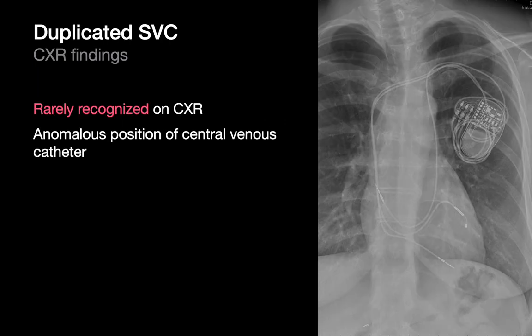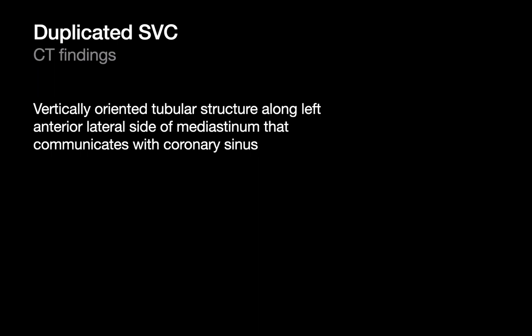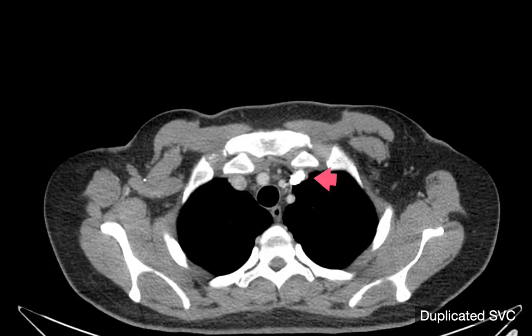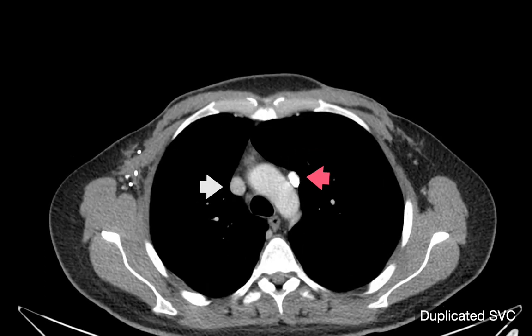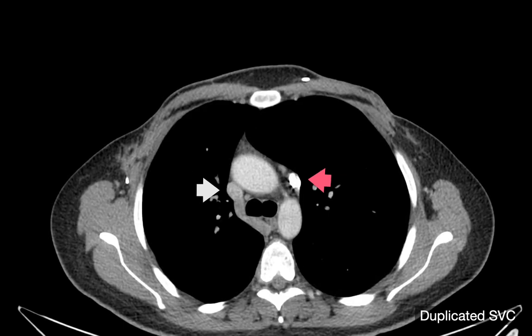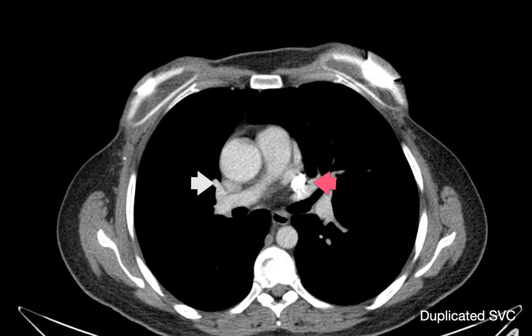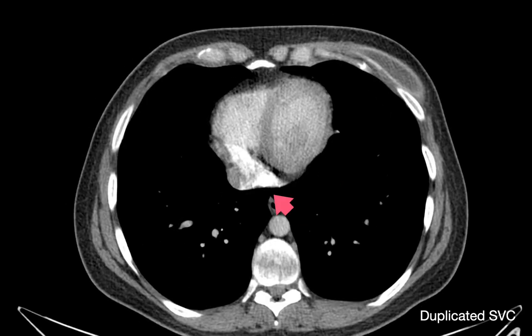Duplicated SVCs are an anatomic variant that's usually not picked up on CT unless a catheter or other central venous device happens to be coursing within a left-sided SVC. On this image, you can see two cardiac conduction leads reaching the heart via the right SVC and one via the left SVC. On CT, you'll recognize a duplicated SVC when you're scrolling and see a tubular structure in the left mediastinum that connects with the coronary sinus. Watch how the contrast column in the left SVC drains into the coronary sinus and enters the right atrium.